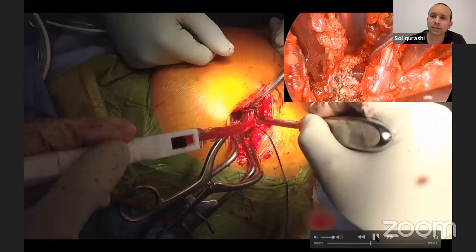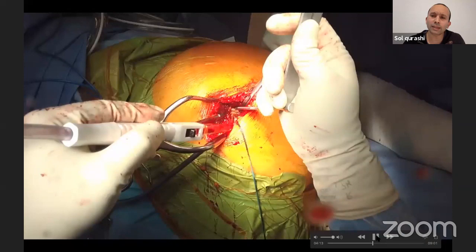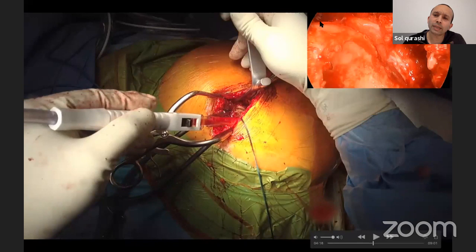So now we put in a little Gelpi retractor inside there, like a self-retainer to hold the leaves of the capsule, and then a Homan. Now I put this Homan here between the anterosuperior capsule and the labrum. So you can see that's 1 o'clock, 12 o'clock, 11 o'clock. That's directly anterior wall, the anterosuperior wall. And you can take the labrum out very, very comfortably.